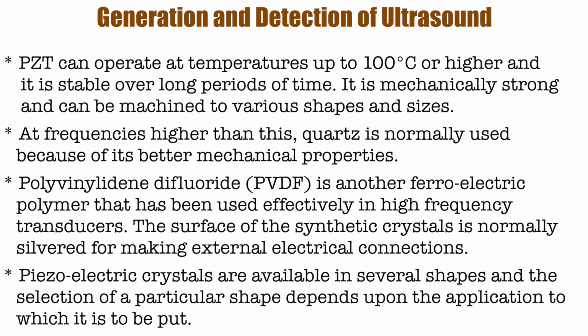Polyvinylidene difluoride (PVDF) is another ferroelectric polymer that has been used effectively in high frequency transducers. The surface of the synthetic crystals is normally silvered for making external electrical connections. Piezoelectric crystals are available in several shapes, and the selection of a particular shape depends upon the application to which it is to be put.